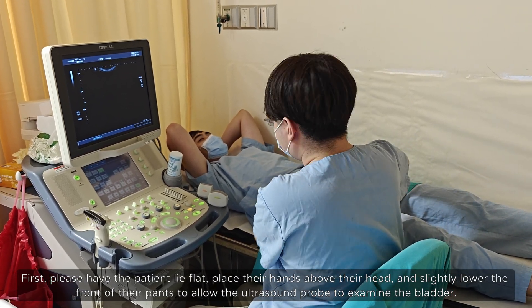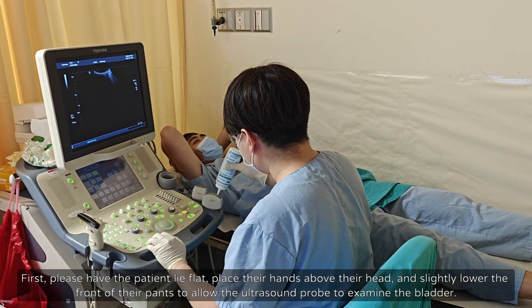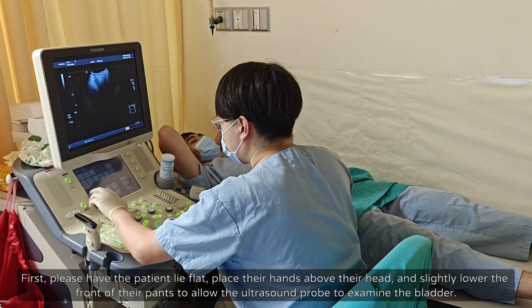First, please have the patient lie flat, place their hands above their head, and slightly lower the front of their pants to allow the ultrasound probe to examine the bladder.